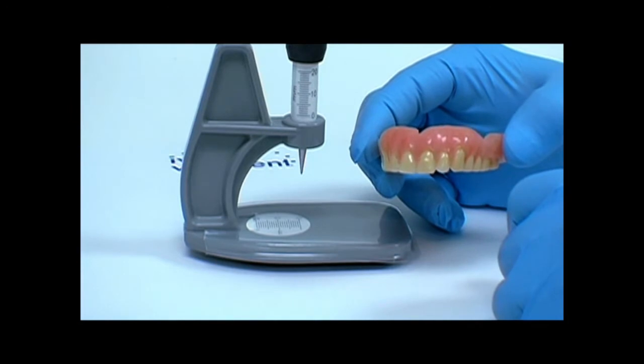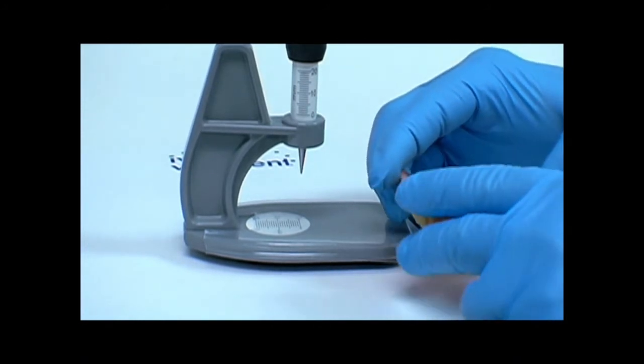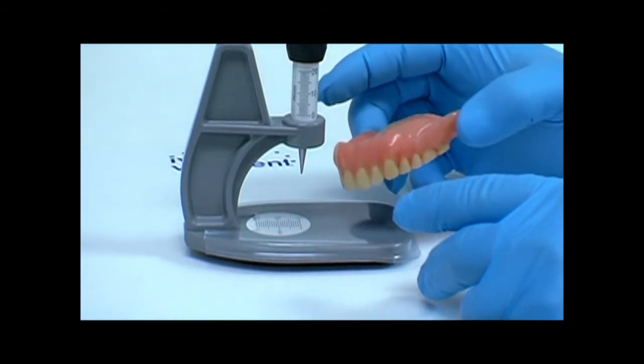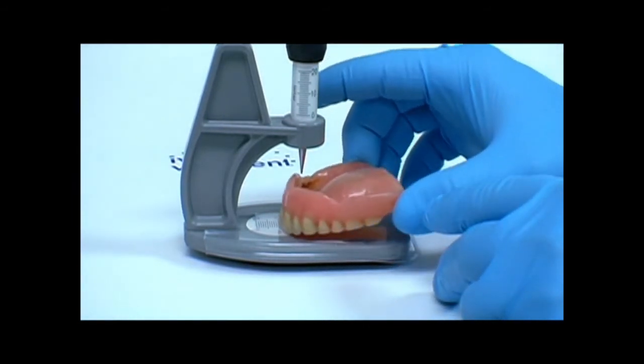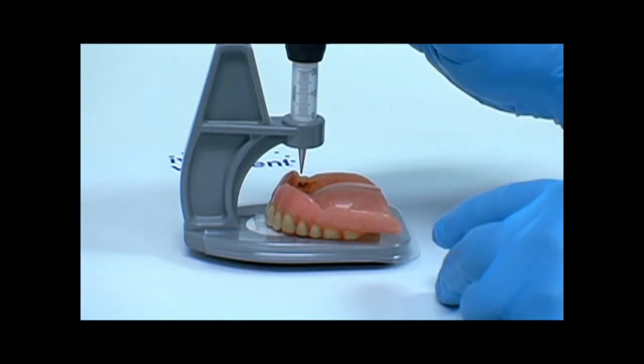That'll help compensate for the ridge resorption and the settling that has taken place. Again, the laboratory will also have an Alma gauge, and they'll have their denture base with the wax rim, and they'll make the appropriate adjustment of the wax rim to an 11 millimeter measurement on their particular Alma gauge.